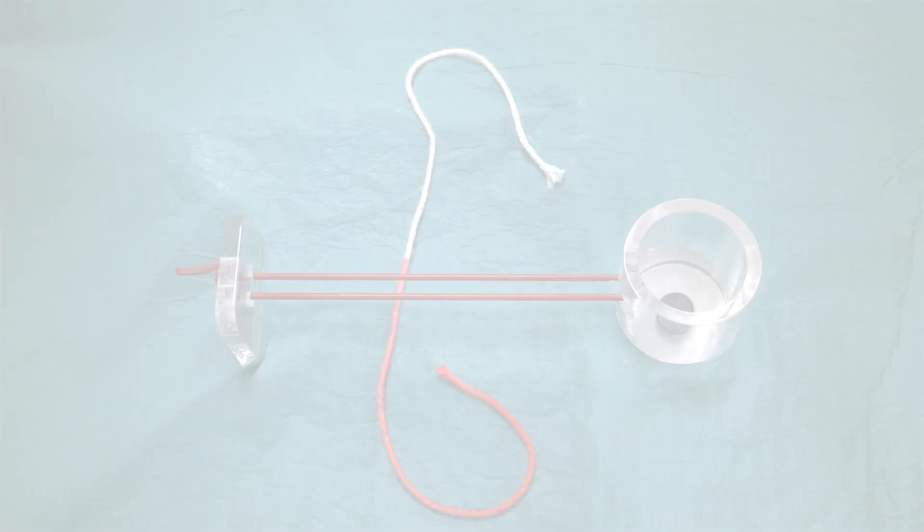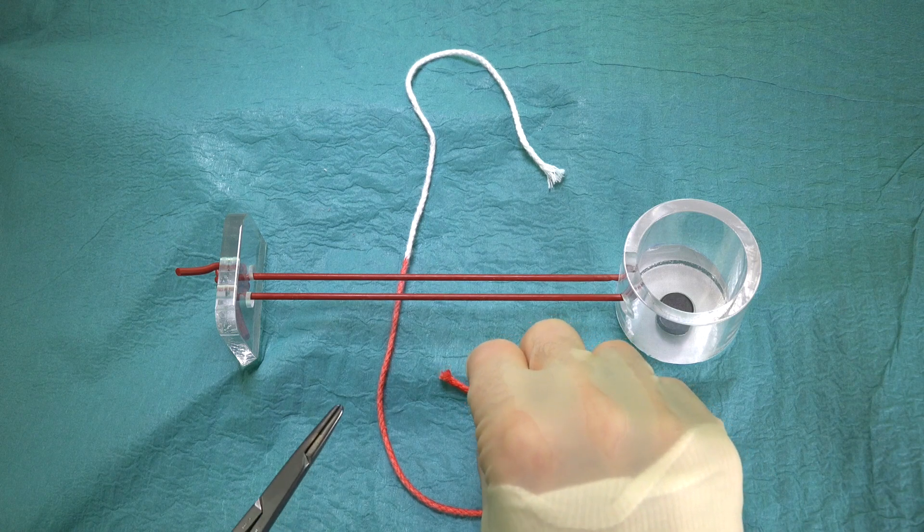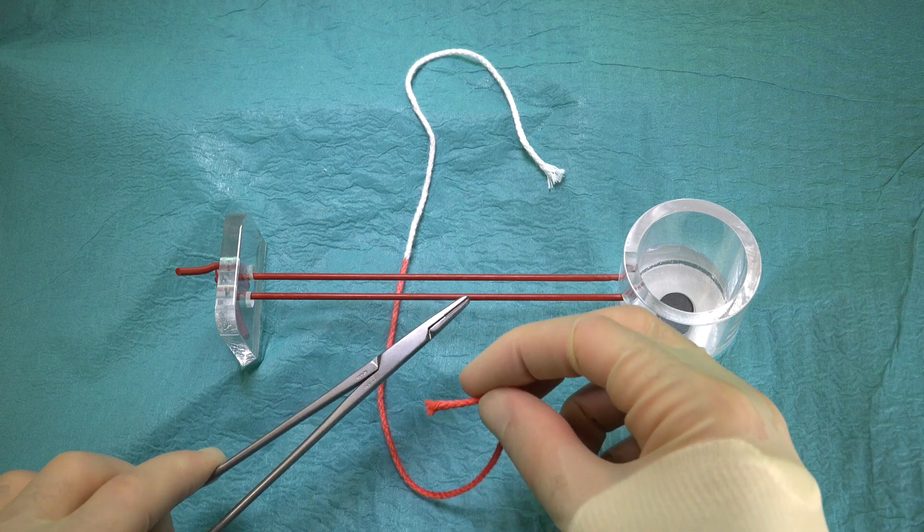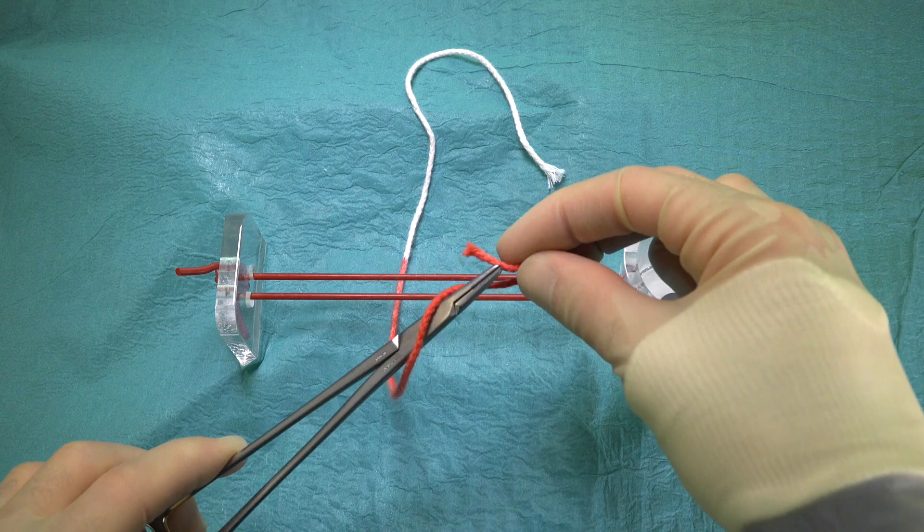We start by holding the end of the suture closest to us in our right hand. The needle holder in our left hand is held out horizontally, lying over the suture. The right hand then loops the suture over the instrument twice to form two loops.